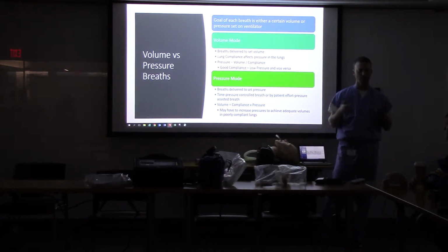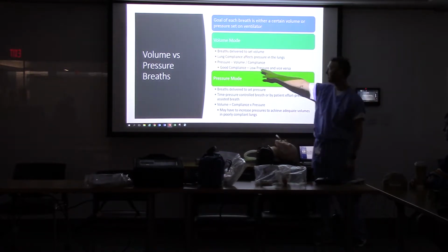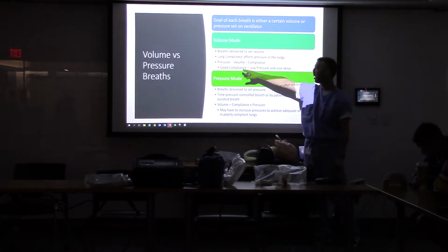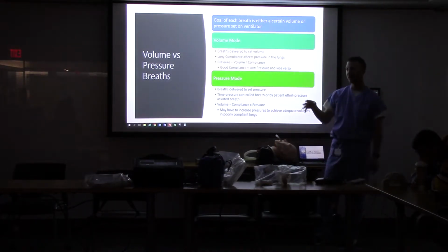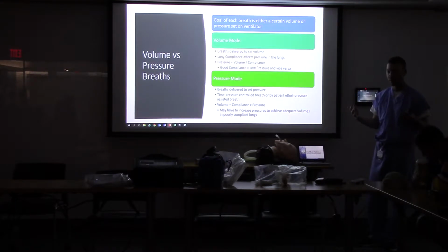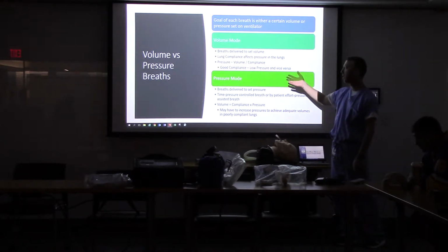They can actually quantify your compliance. So a large number would be a good number to have in this situation. And so you can see that as the volume stays the same and this number goes up, the pressure is relatively small. So good or high compliance with a fixed volume equals low pressure into the chest, and that's what we want. We don't want high pressures in the chest because then bad things can happen. The chest can get overfilled with pressure and blood can't flow in, and all kinds of problems can happen. And so with non-injured lungs, pressure can stay low.